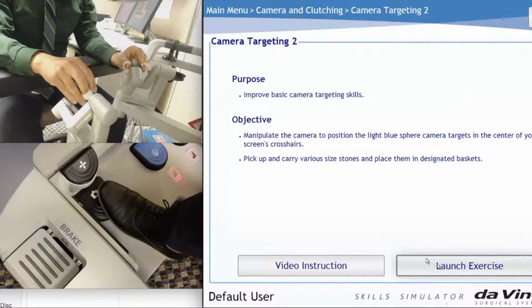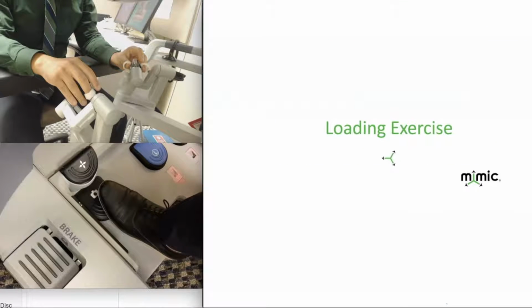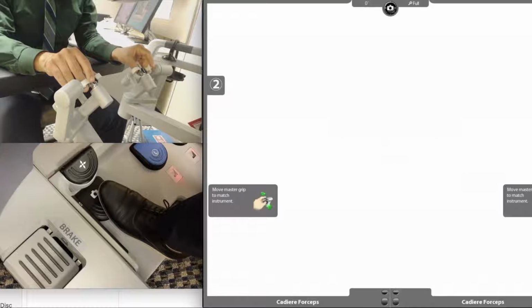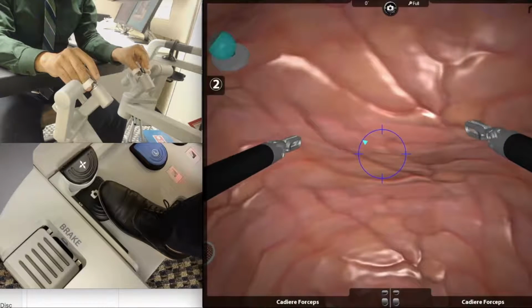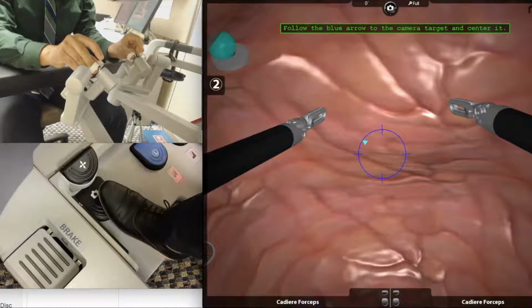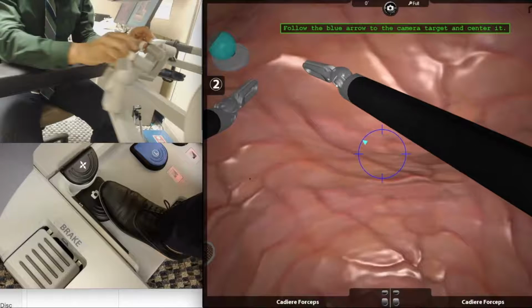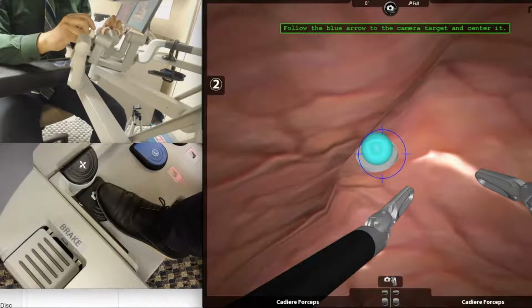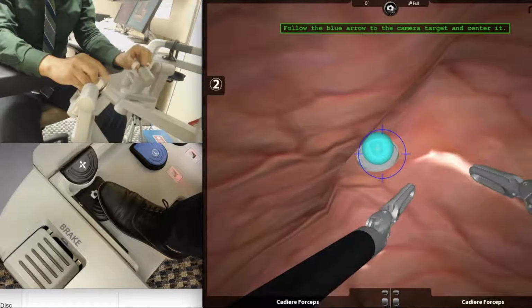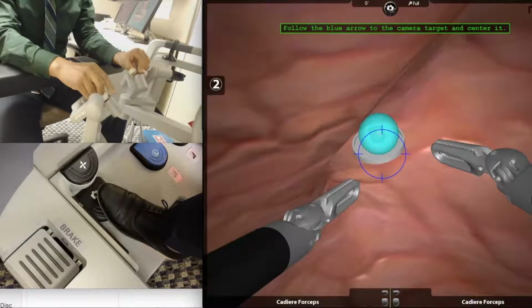This is a slowed down version of the task to enable step-by-step instruction. Moving towards the first target forces you to raise your forearms off the armrest. You then have to activate the clutch to maintain your forearms on the armrest at all times. Here I engage the clutch twice.